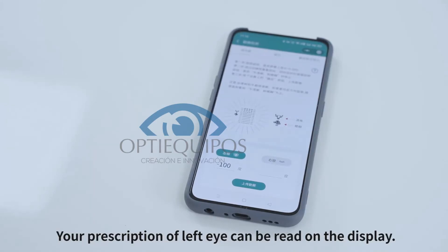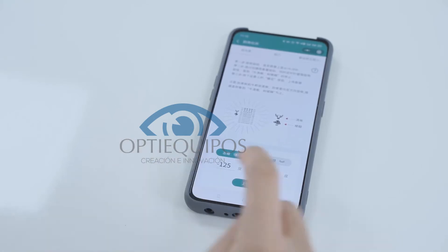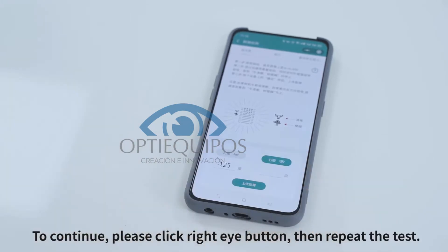Your prescription for the left eye can be read on the display. To continue, please click the right eye button, then repeat the test.